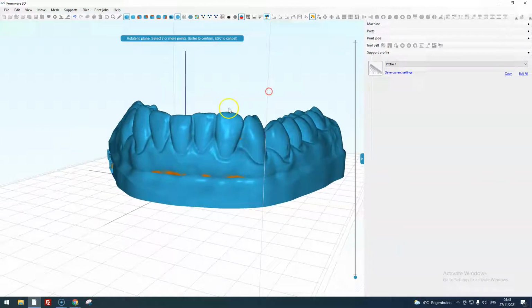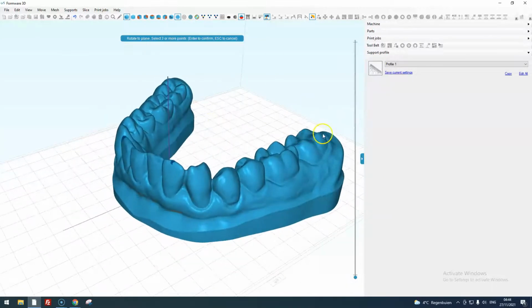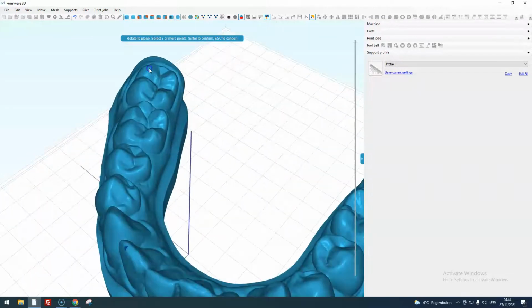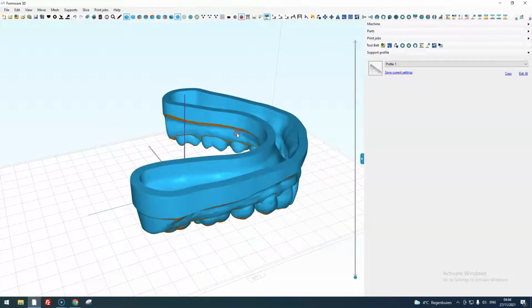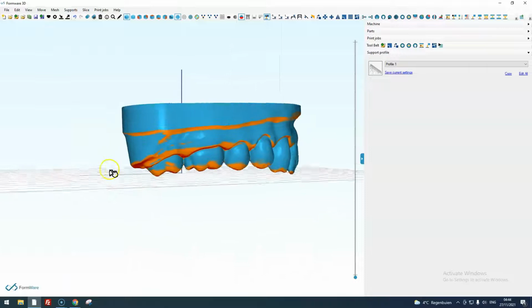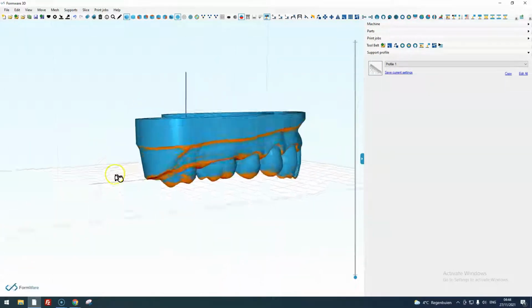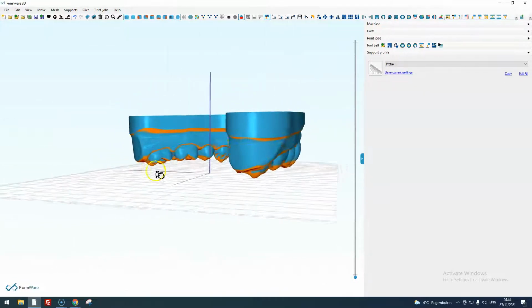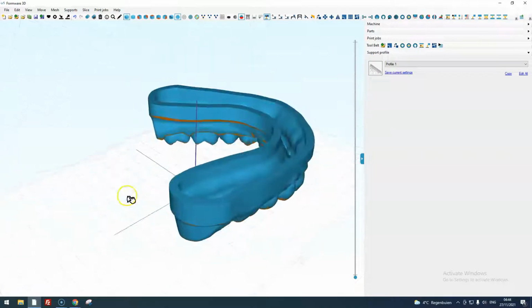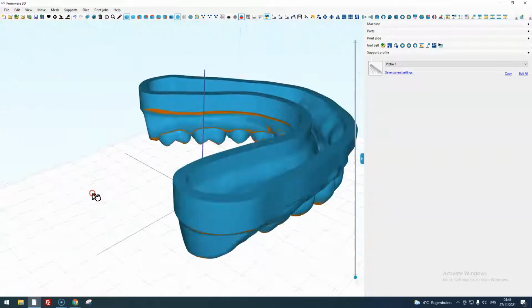So the first two points will be here, and then I would use two more points here on the end, one there and one there. Then pressing enter will rotate the part, and it will have calculated a virtual plane through the clicked points. And this way I'm able to pretty accurately rotate the part to an orientation where I couldn't find a face that was aligned to that orientation.